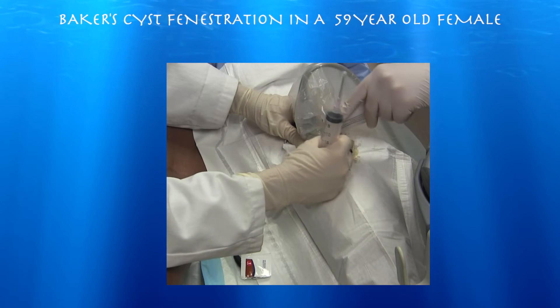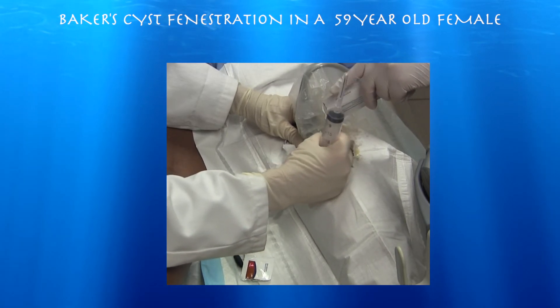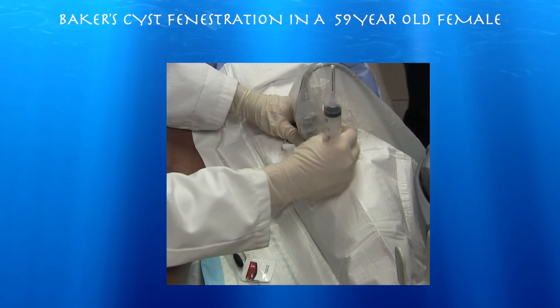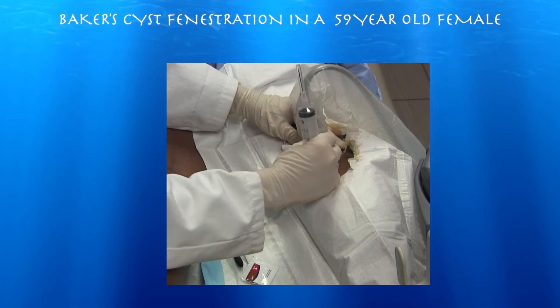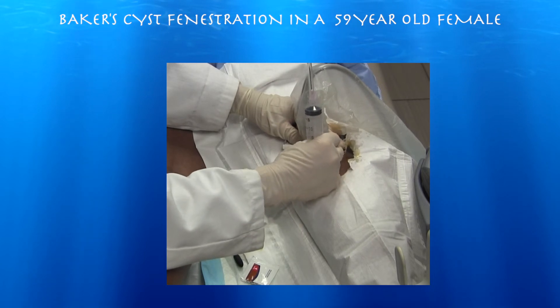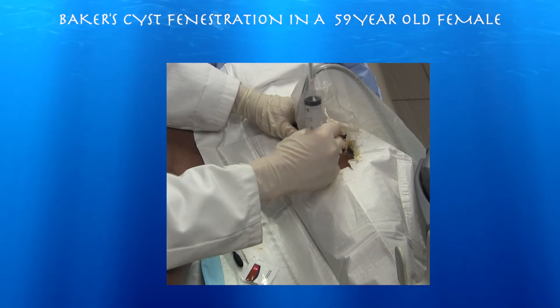The question is: when should you break it up? You really only see the wall when it's filled with fluid, but then again you don't want fluid to track down the calf — you don't want to mimic a ruptured Baker cyst. So what I may do is drain a little bit of it and then try to break it up.